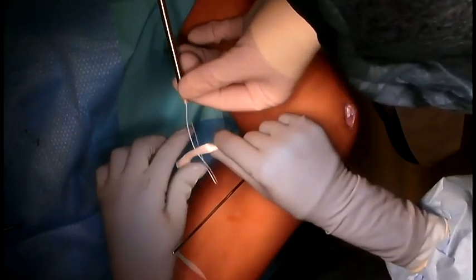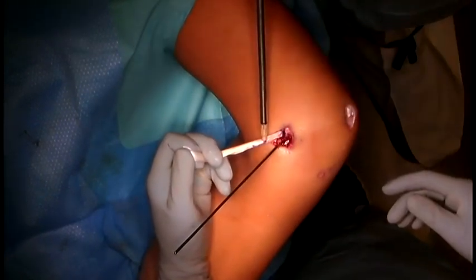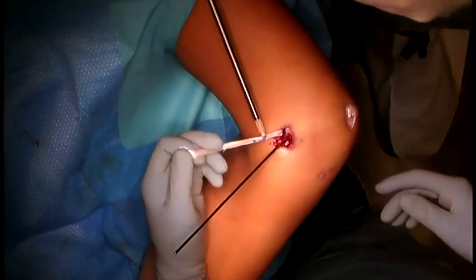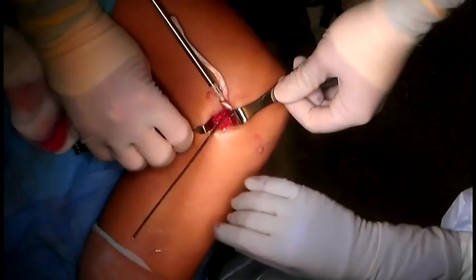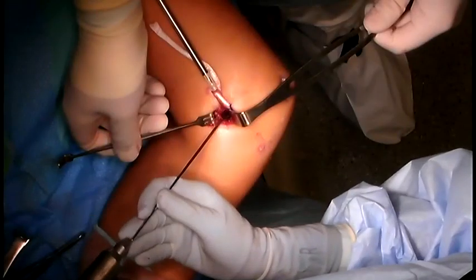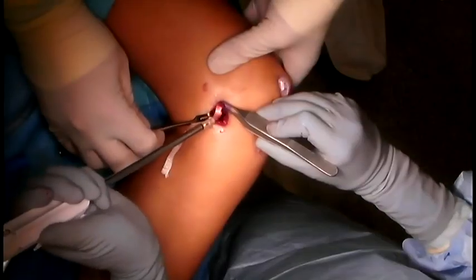The graft is marked at the aperture of the tunnel to set the appropriate length of the graft for the reconstruction. In this case, a 20 mm anchor is utilized and a second mark is placed on the graft 20 mm distal to the aperture marking. The femoral tunnel is then reamed and the graft is secured to the fixation device.